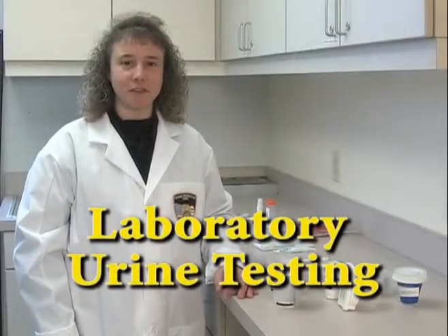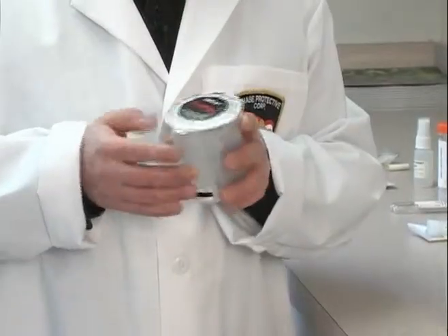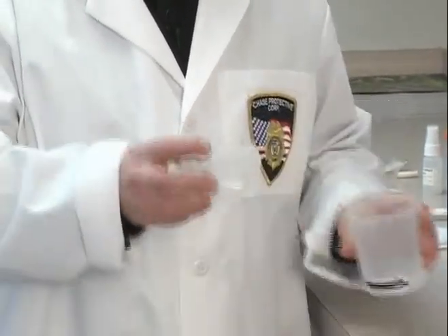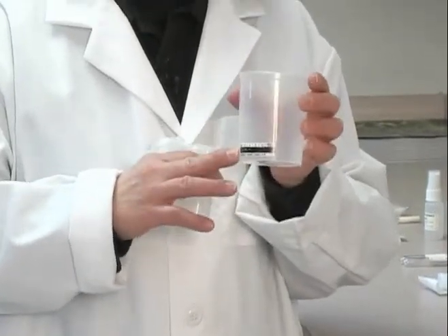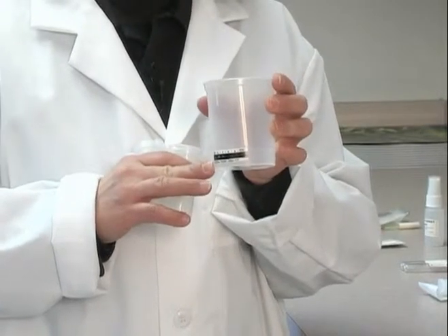The first testing we're going to talk about is urine laboratory testing. The kits look like this — they have a sealed top on them, and inside are two vials. On the outside of the cup is a test strip that shows temperature once the urine is in there, to make sure it is the right temperature.